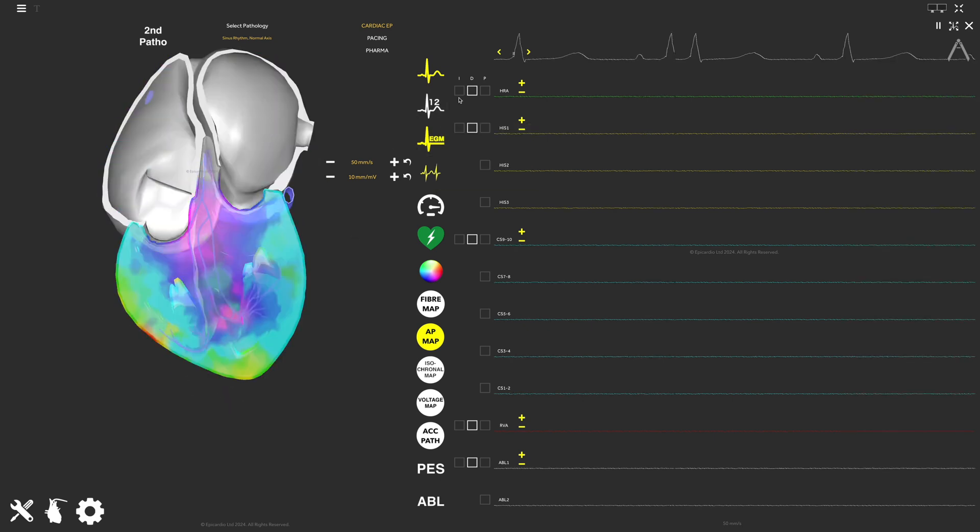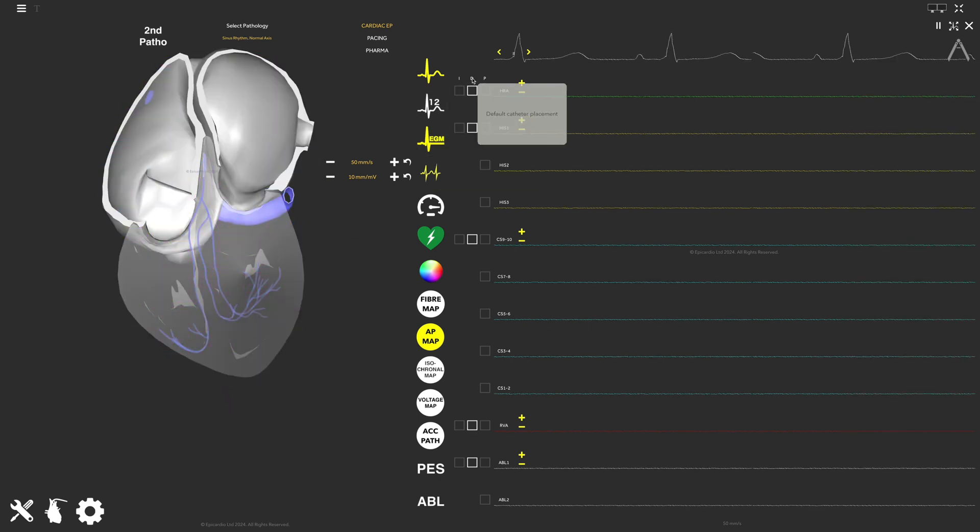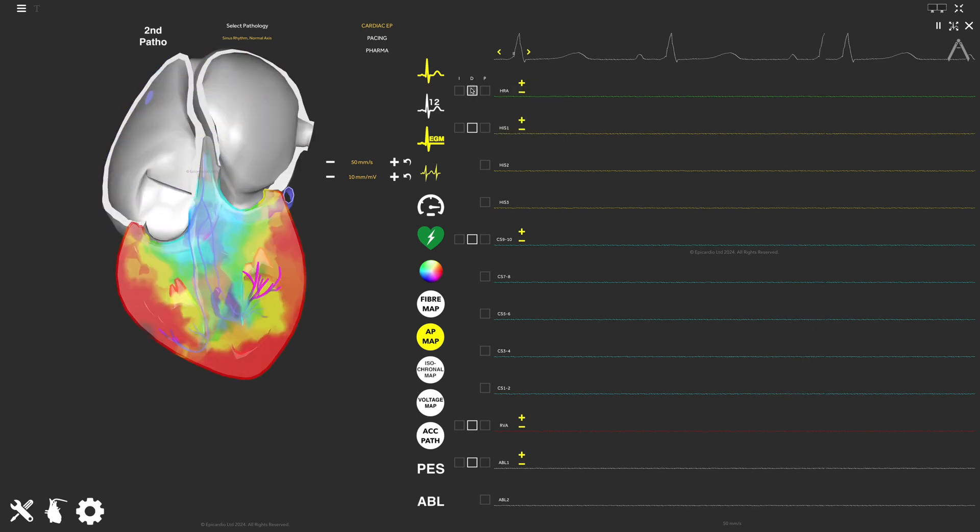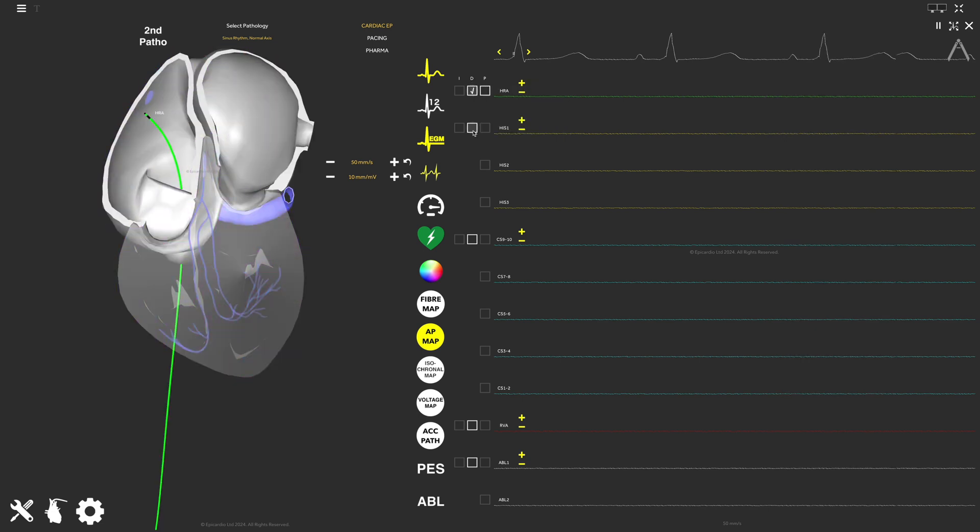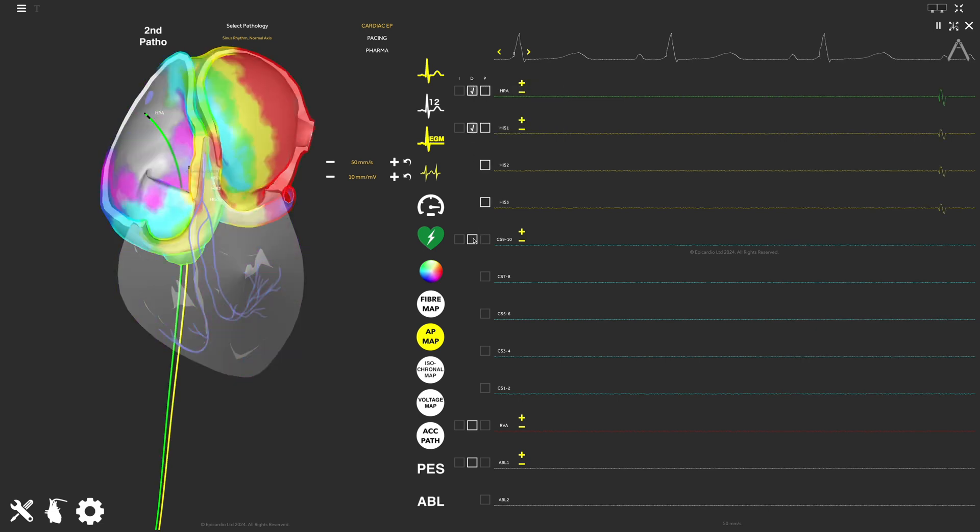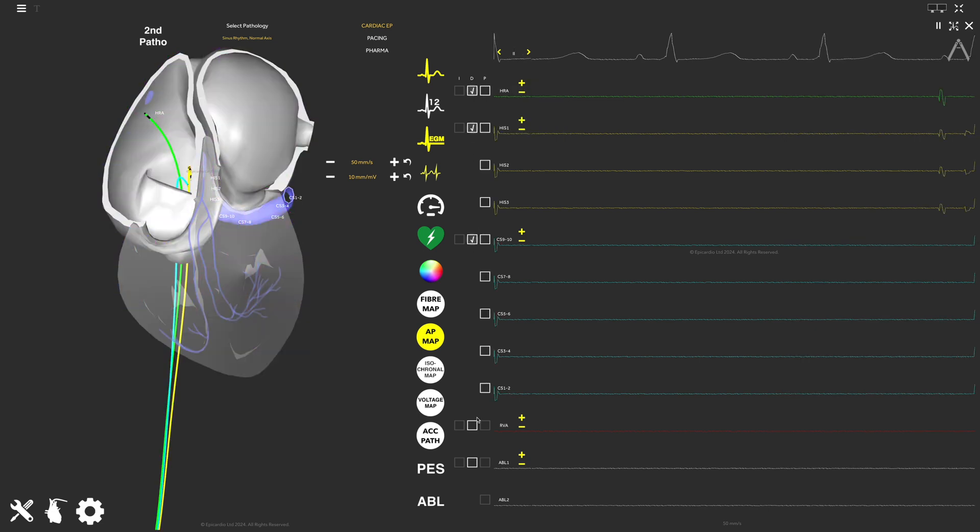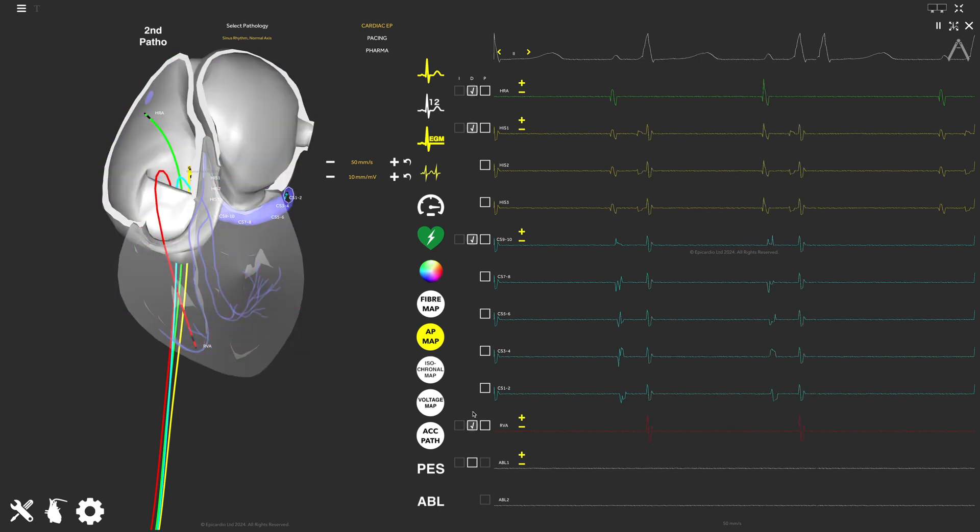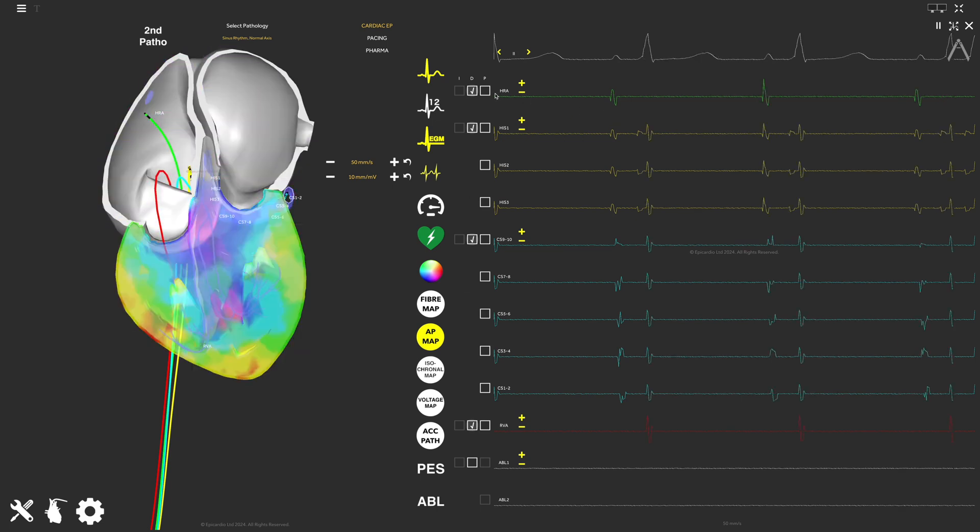By ticking the boxes under D, you can insert the EGM catheters to their default positions. You can insert the HRA, the HIS, the CS, and the RVA catheters.